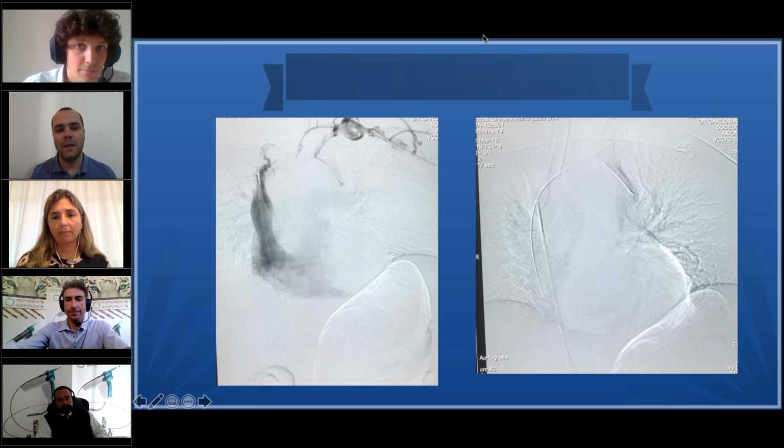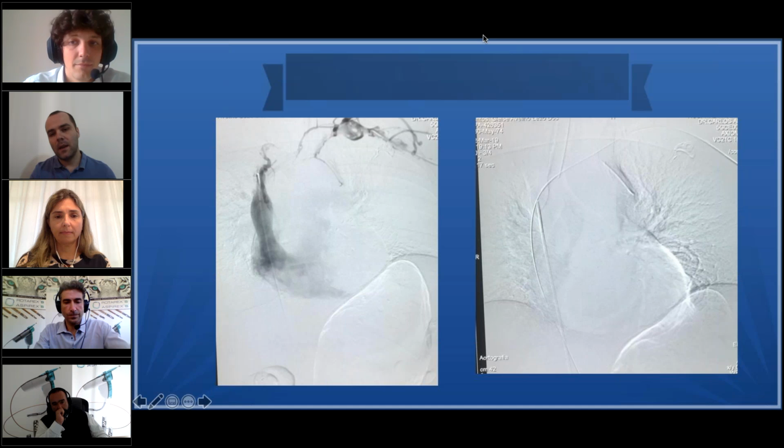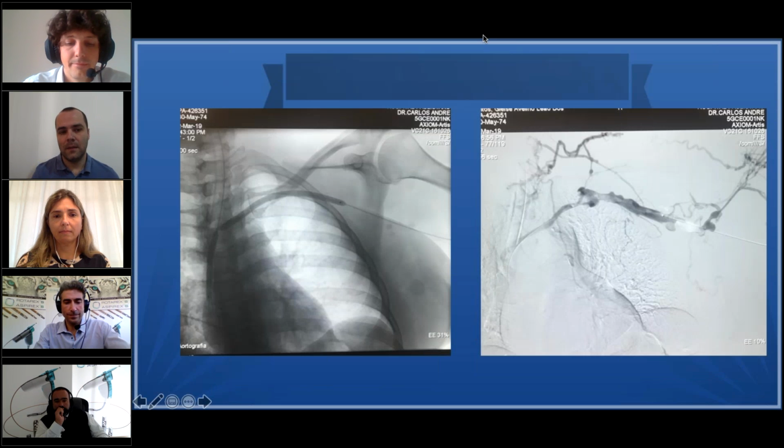I went in through the fistula and through the femoral vein as well, and I did the angiography at the same time. Afterward, I could transpass the guide wire. The procedure sometimes takes too long, but you realize that it is going to be okay, and you're going to make it possible. On the left, you see the first angioplasty and the first control.